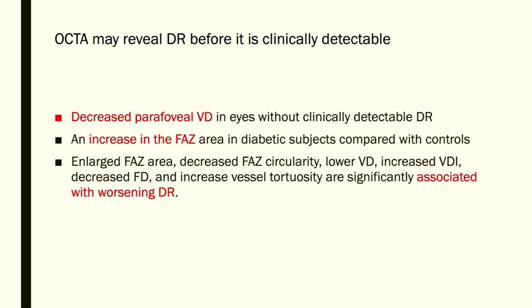As more and more patients are diabetic, there are so many diabetic patients who have not yet developed diabetic retinopathy. A lot of research has been done with OCT angiograms, and they have seen that even if they don't have an obvious diabetic retinopathy, vessel density is already reduced. So the importance of this is so huge. It's a non-invasive method. You start seeing the machine giving you the calculated vessel density. You put the patient on better control, and they may never develop diabetic retinopathy.